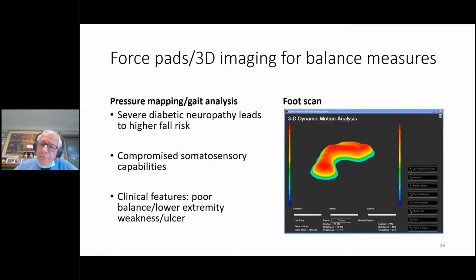So we have measured improvements pre and post Provant interventions, typically 4 to 6 weeks. It does take some time, and these guys are usually on a 3 times a week single treatment regimen. So again, we deviated a little bit from the Regenesis protocol, but part of what we do is explore all the different combinations, permutations, if you will.